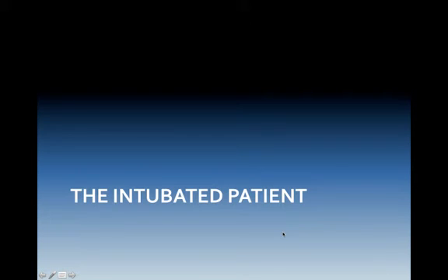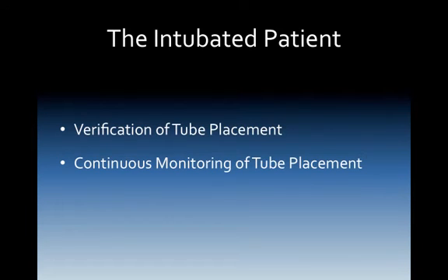Alright, the intubated patient. A couple things we get really quick off of monitoring an intubated patient with end-tidal CO2 is, number 1, verification of tube placement. If we get capnographic waveform, that tube is in the right location. And it also gives us continuous monitoring of tube placement. So if all of a sudden we had great capnographic waveform and good numbers, and then all of a sudden it just drops off the face of the earth, there's a good chance that either we have mucus plugging, 1, or 2, we might actually have extubated the patient.